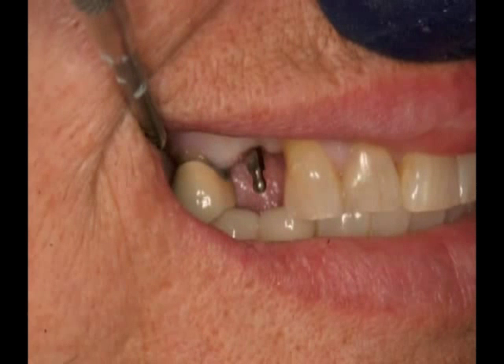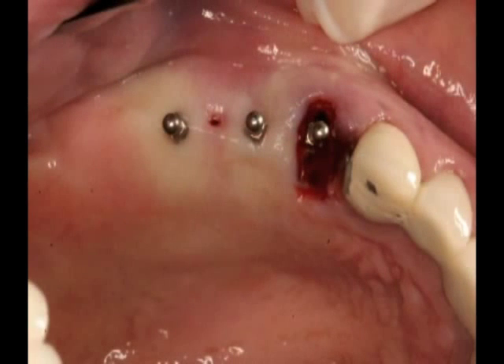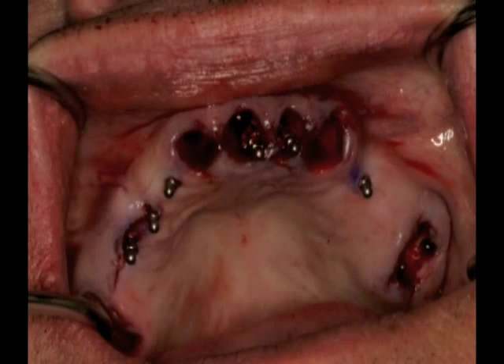Denture stabilization with mini dental implants has become a popular treatment modality for a number of factors. Firstly, the need is obvious. Lower dentures present a problem with nearly all patients with a full lower denture prosthesis, especially those with a resorbed ridge. The retention gained from this simple procedure has been reported to improve satisfaction by seven to eight times in the literature.